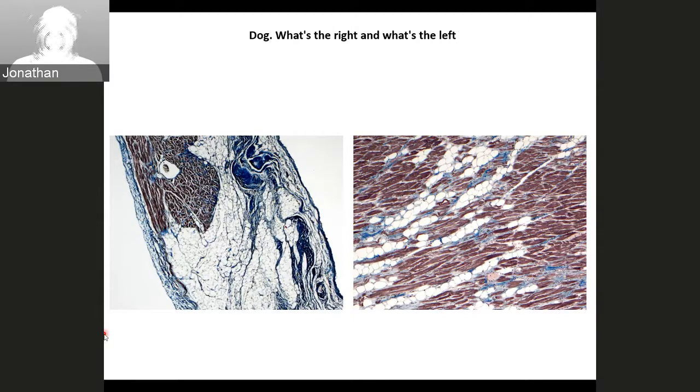This is a paper in dogs that's recently been published with microRNA and doxorubicin toxicity with some histology, and they showed this fatty infiltration within the left ventricle also, which looks similar to me. So maybe you can have a look and let us know what you think about the descriptions they provided.